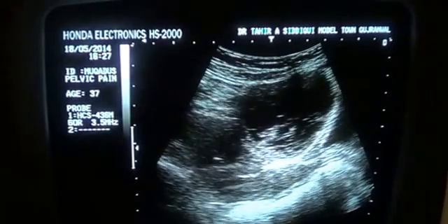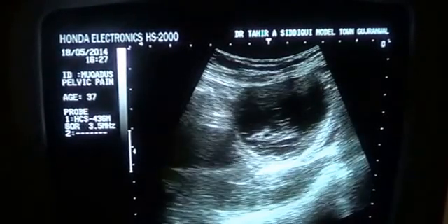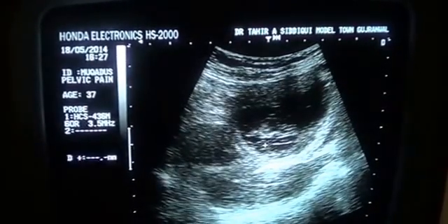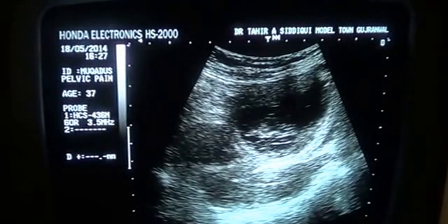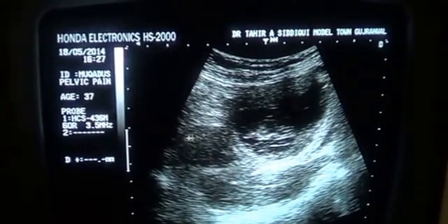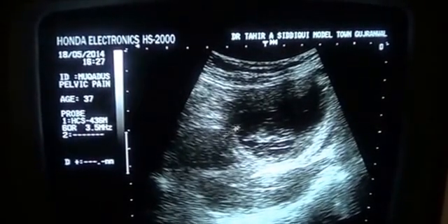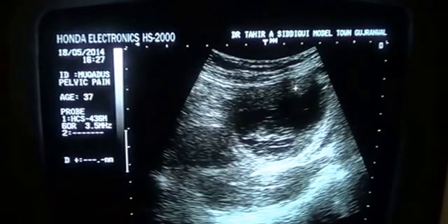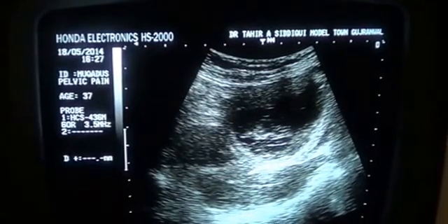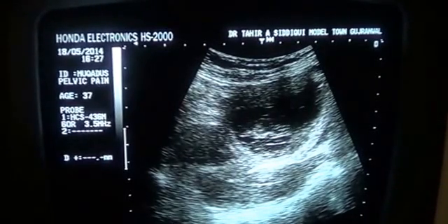Now here you see that this is the cystic area in the fundal region with echoes. This is not clear. This is the lower segment of the uterus. This is the cystic area, and there are echoes within it. And from here, this is the area where it communicates with this larger cyst seen anterior to the uterus. And now these are all septa. This is debris, and this is a thick wall cyst.